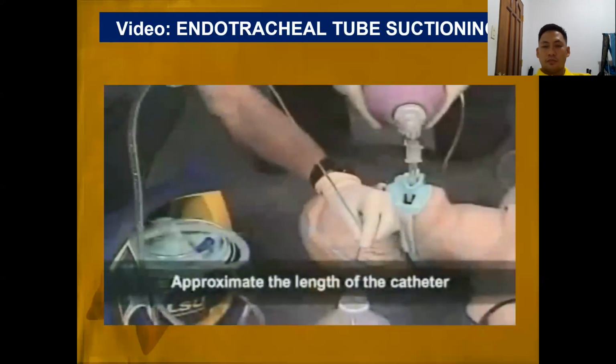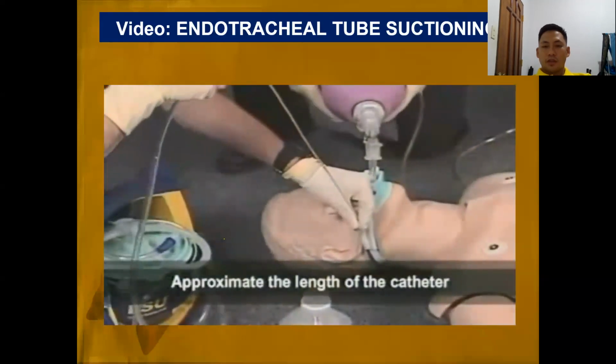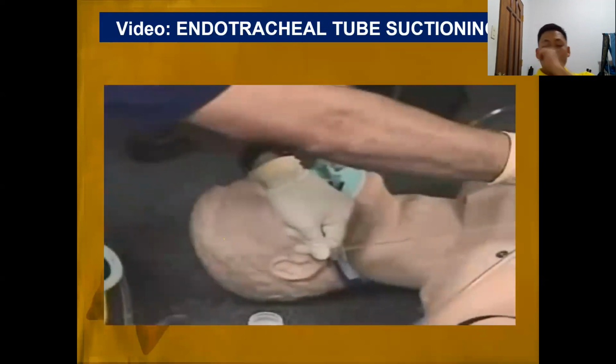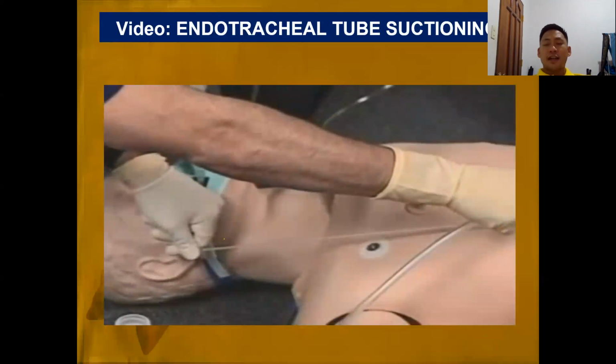However, for most cases, if the patient has debris or vomitus in the ET tube, then just suction directly and do not bag the debris down the tube into the lungs. Approximate the length of the catheter to be inserted. So that is how you measure the approximate length of insertion of the suction catheter. This is about to the level of the carina.